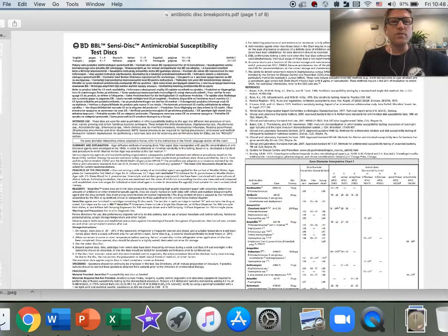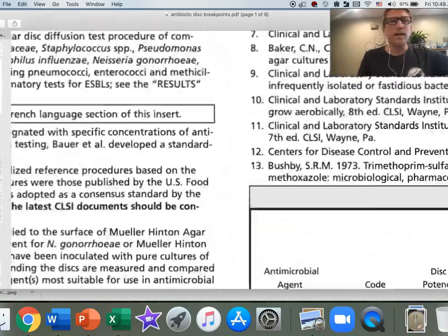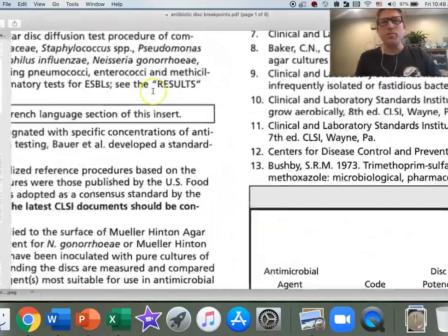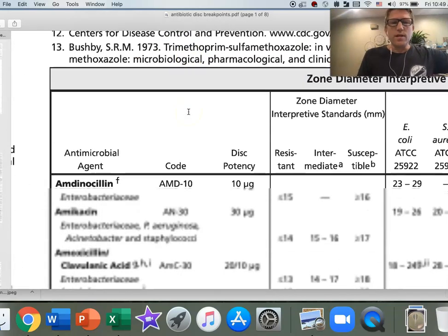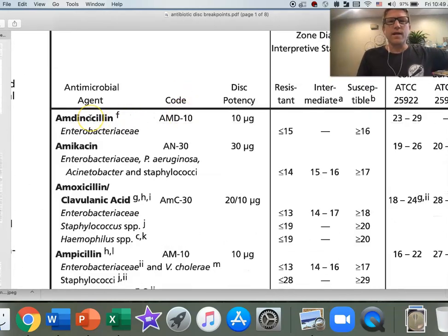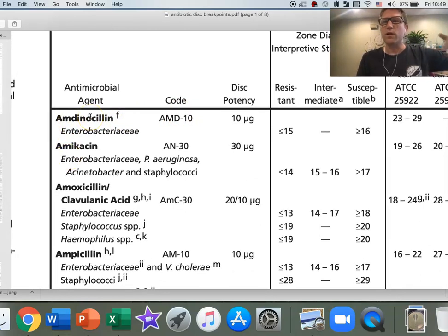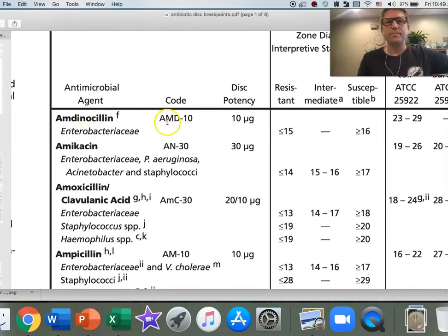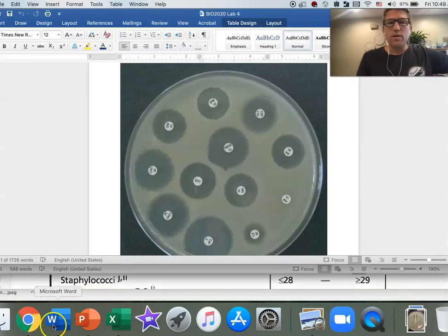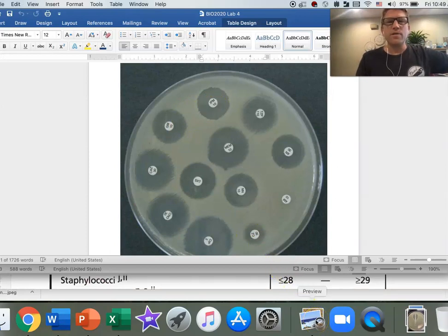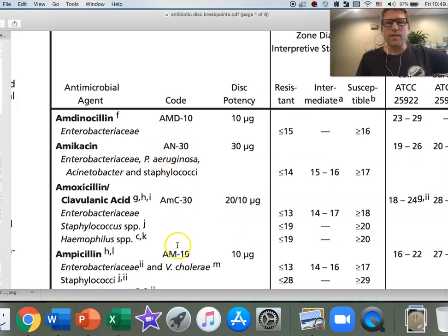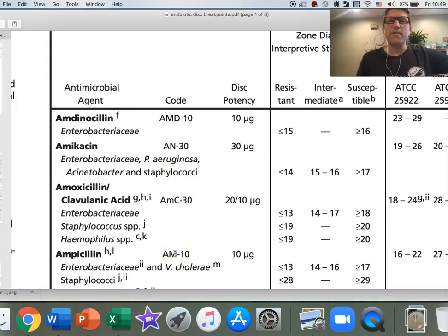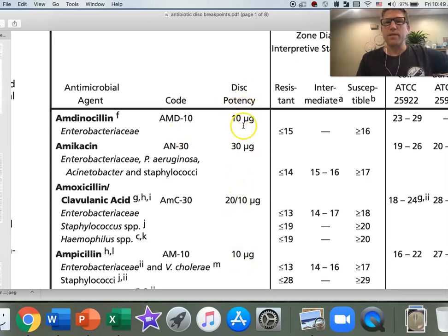This section shows all of what are called breakpoints. I'm going to zoom in so we can actually see it. On the left-hand side, you've got an antimicrobial agent, an antibiotic, and they're alphabetical. There's an abbreviation here because if you saw on the disc, you can see IPM. What the heck is IPM? You don't have to have them memorized, but if you do this enough, you will. We could look for that and find, oh, I didn't know it was imipenem, but I found IPM. That's imipenem.